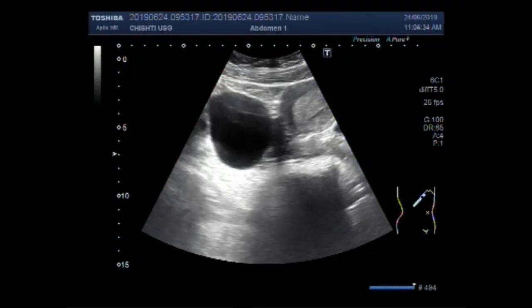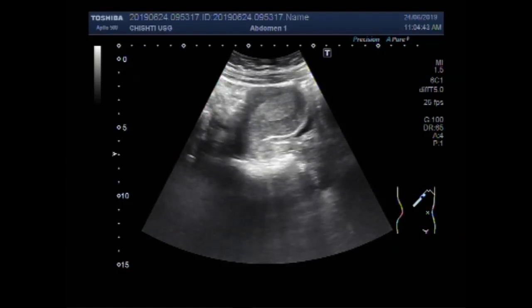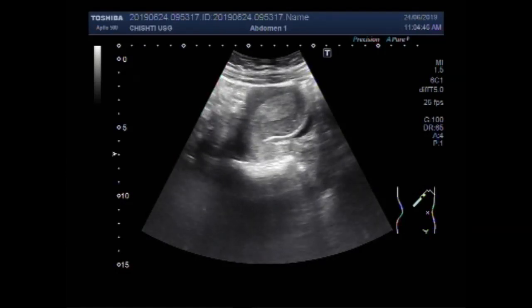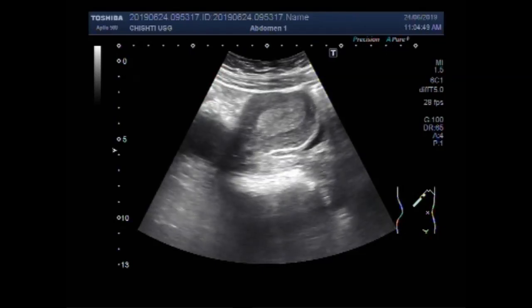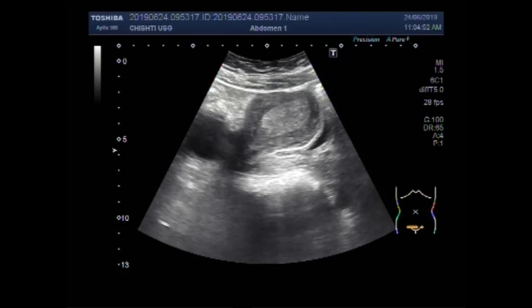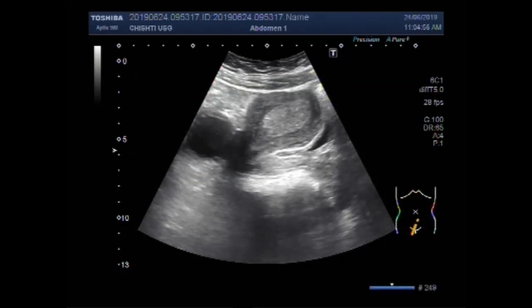Dear viewers, I hope you are all fine. This ultrasound video shows scanning of the uterus and ovaries. You can see the uterus — this is the uterus, this is the cervix, and this is the urinary bladder.